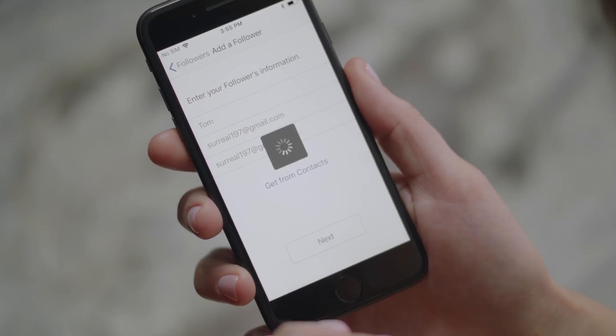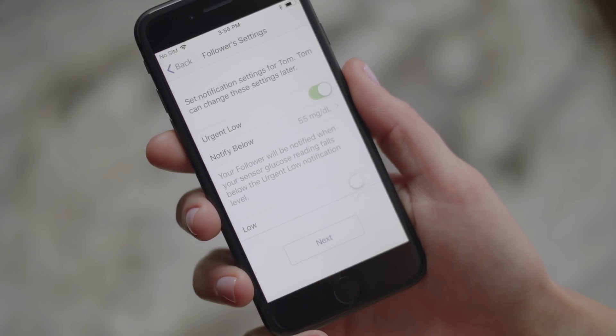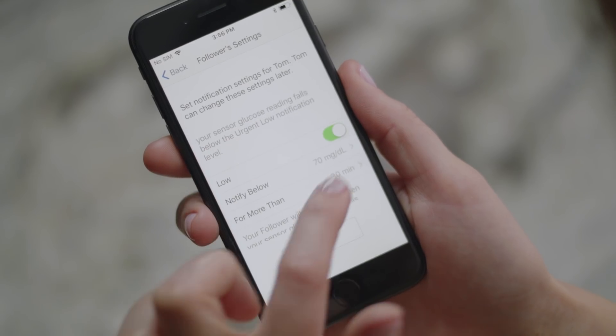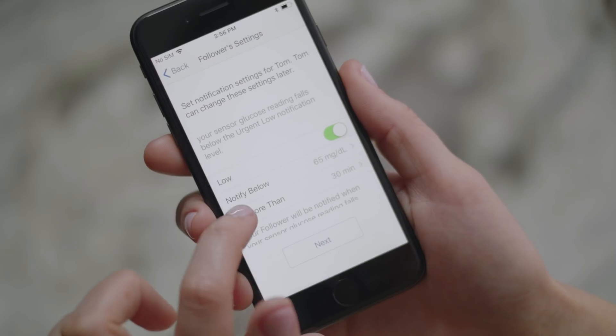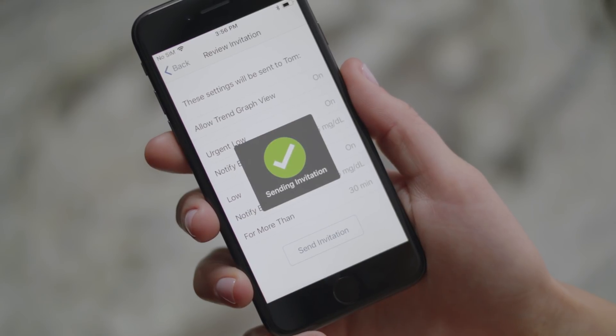Then choose follower settings. First, choose if you want your follower to see your trend graph, then choose which notifications you want them to receive. I'm going to leave urgent low on and then change my low to 65, because I usually start to feel low around 65. I set my low alert higher so I should catch my low before I hit 65. Then review your invitation and send it — this will trigger an email that is sent to your follower.